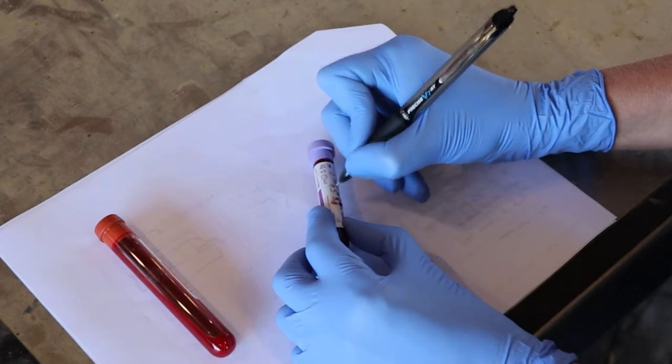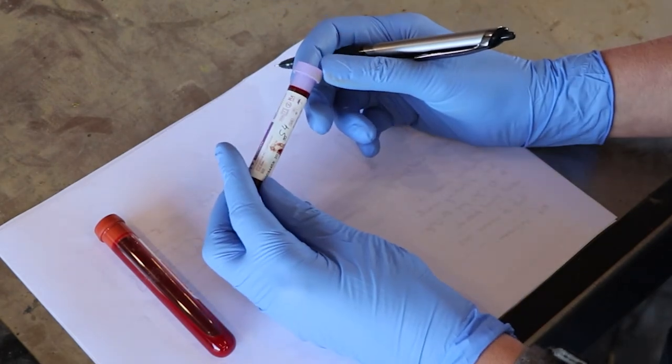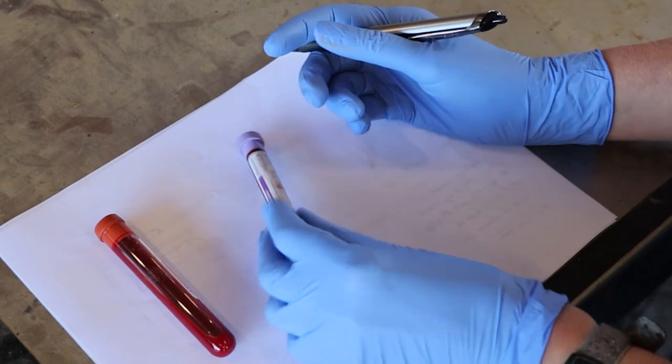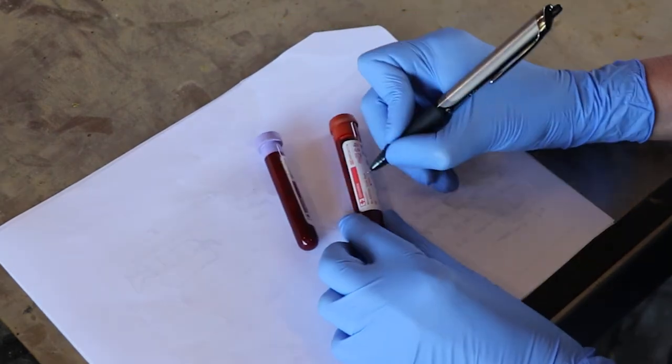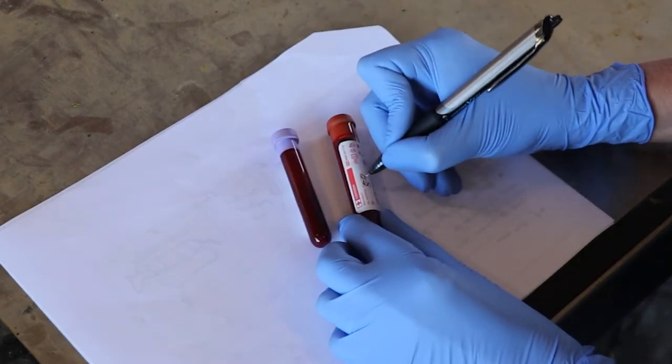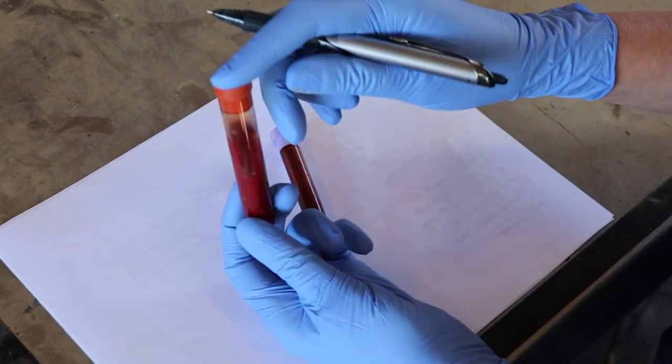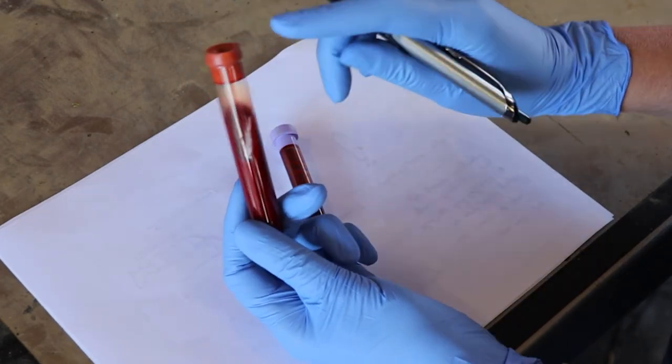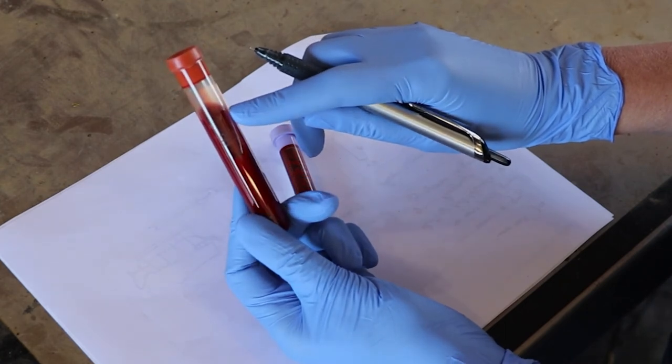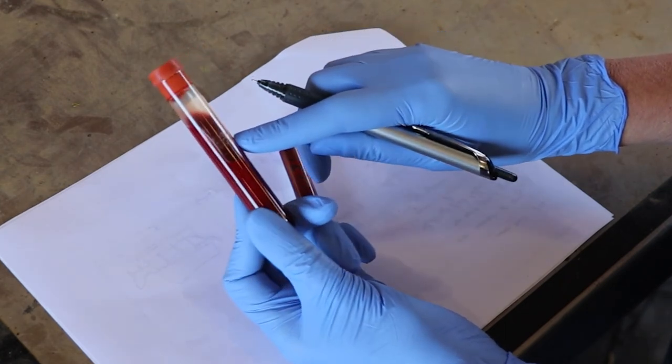Don't forget to label the tube with an ear tag number or other identification so you know which animal it is from, and then of course repeat that if you take more than one blood tube. So again, this is a red top tube so you can already see a blood clot forming as the red blood cells separate from the serum in these types of tubes.